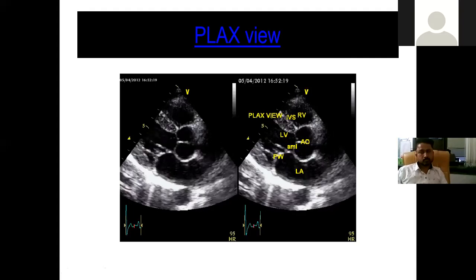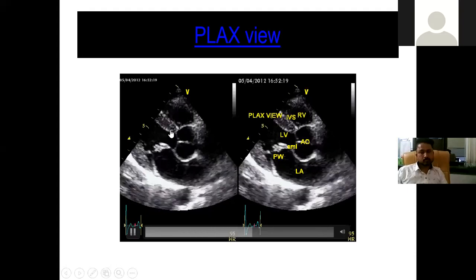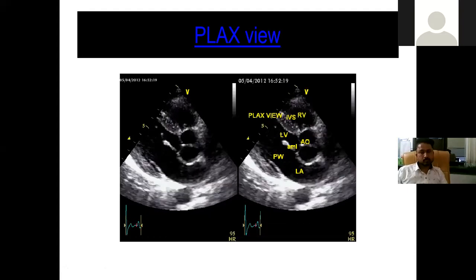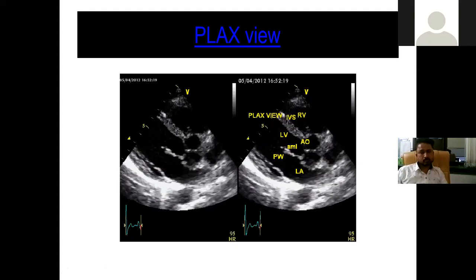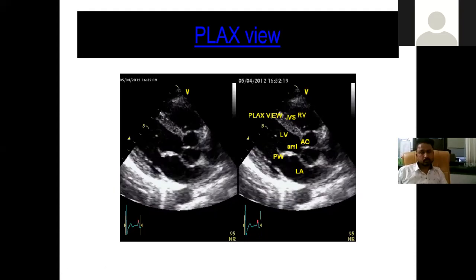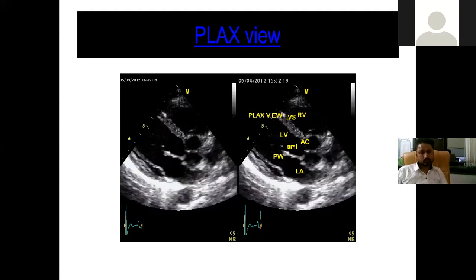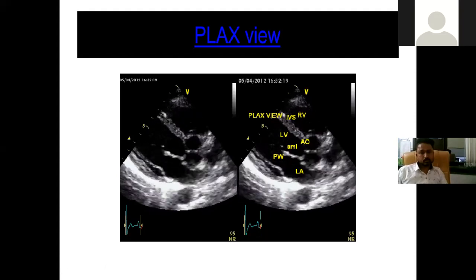If the anterior septum is spared, it means I'm dealing with a lesion distal to the D1 branch of LAD. So possibly I'm not dealing with a proximal LAD lesion, I'm dealing with a mid LAD lesion. Diagnosis.